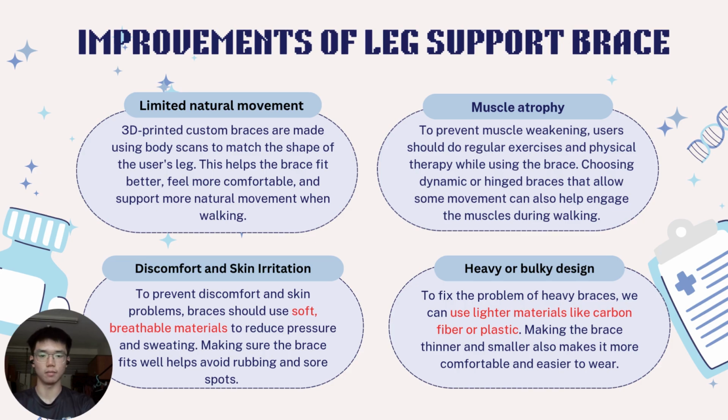The last is heavy or bulky design. To fix the problem of heavy braces, we can use lighter materials like carbon fiber or plastic. Make the brace thinner and smaller, also make it more comfortable and easier to wear.